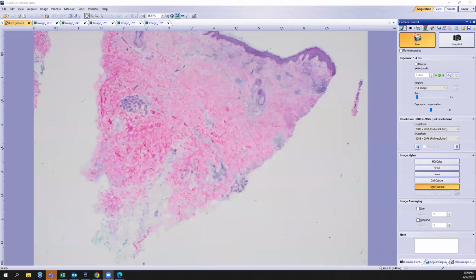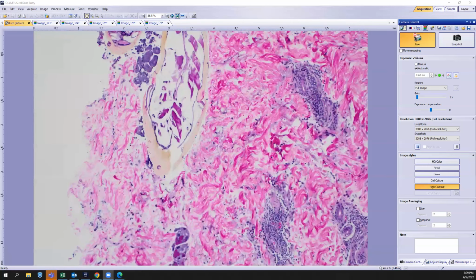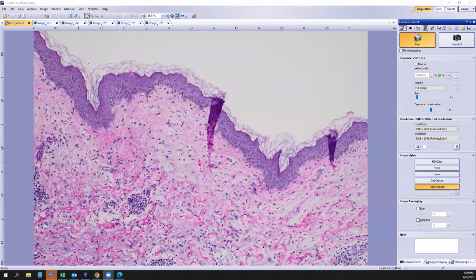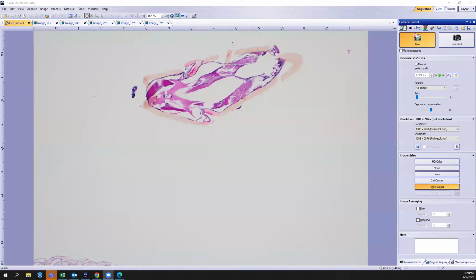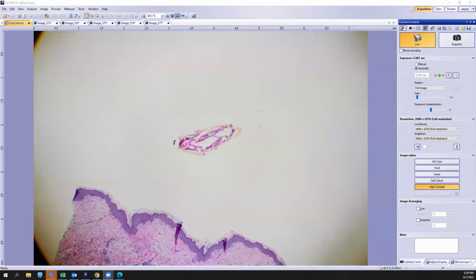And just one more view. So they may show you something like this and expect you to make the diagnosis of a tick or mouth parts of a tick just with this here. So review a couple of examples of these. Now I can't tell you exactly what type of tick it was here. Obviously that's for another lecture, but just be able to recognize a tick on histopathology.